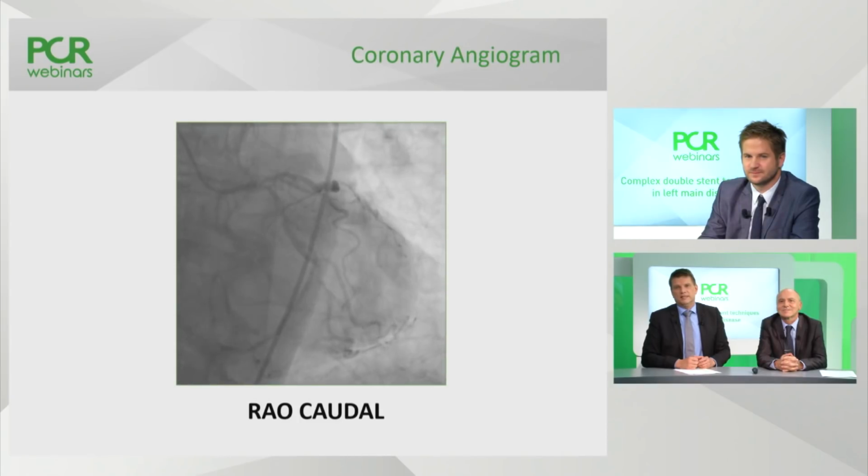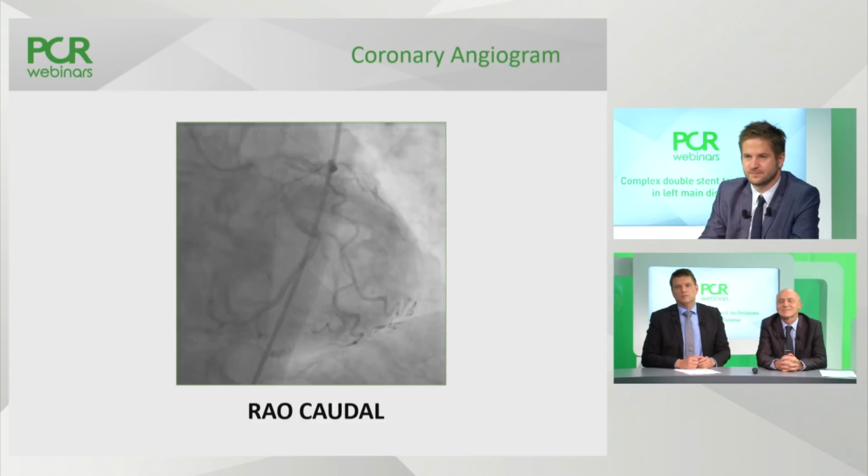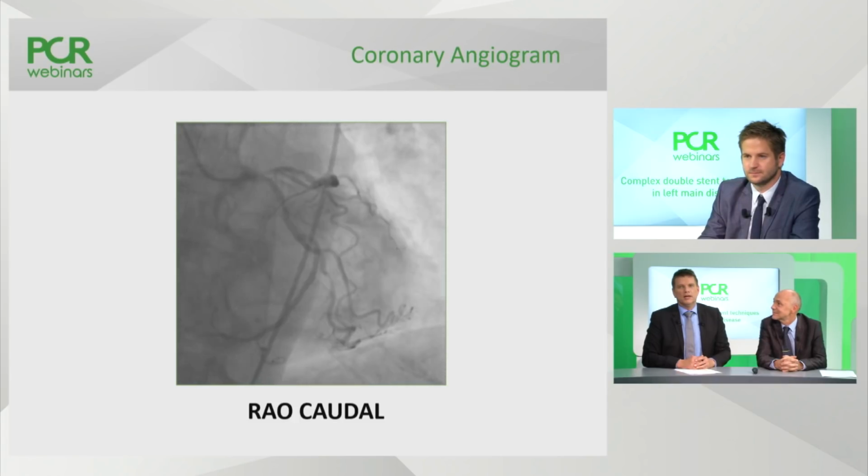So now, after this descriptive explanation, I also need an answer on the strategy you would go for. Yeah, I mean, we have again the same questions. After analyzing the anatomy, we know the most severe stenosis is in the LAD. Well, the circumflex is big, but I'm not so much afraid of losing the circumflex in this case.